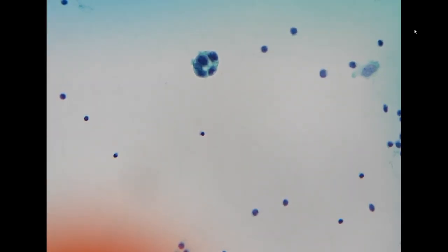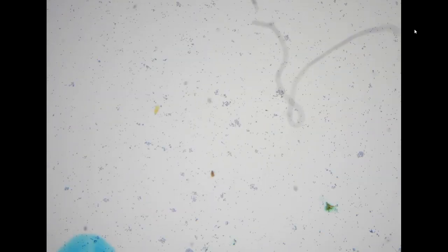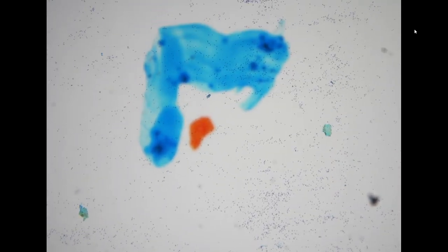Just by morphology, in this specimen, we only have this one cluster of cells. This looks very similar to the prior specimen. I think we can call these suspicious because the patient doesn't have any proven biopsy. This is her very first specimen, and they only gave us 2 milliliters, and we only see one cluster of cells. So we call these suspicious. But the morphology is very similar. In this specimen, it even shows a little bit more nuclear atypia.